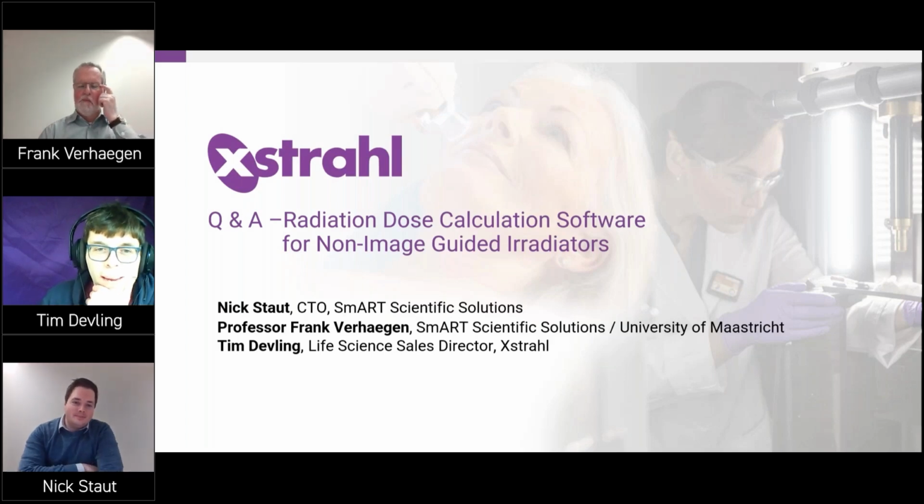So if you use a 96 well plate and you cover half the plate with a lead shield, do you think it would be accurate enough to calculate the dose delivered to the cells underneath the shielded part of the plate? In theory, you can do that. At this time, we don't support shields on top of the well plates yet. To get good resolution, the well plates are a bit more restricted in what you can add from shielding. We will add that later.